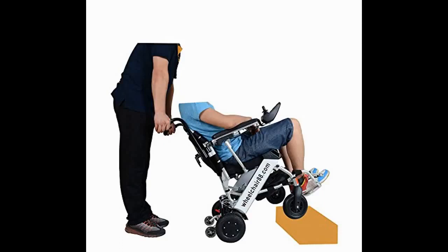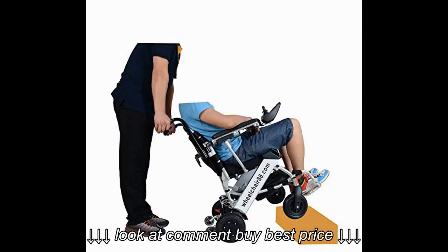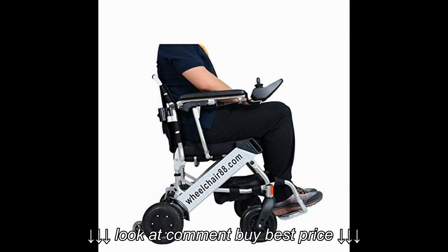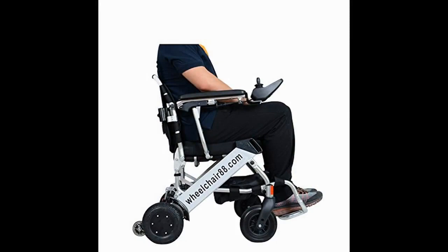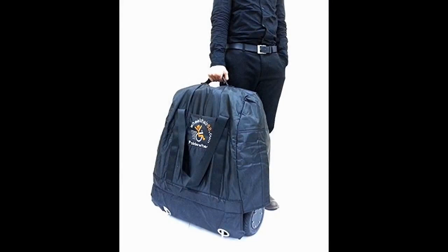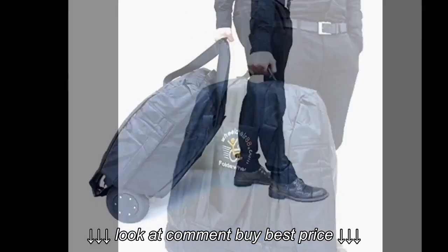Hi. I bought this chair for my wife. Most electric wheelchairs are big, bulky and heavy, and unless you have a vehicle large enough for one, or a trailer hitch and platform designed to carry one, traveling with one of those other chairs is a big hassle. So much so that my wife was resigned to being pushed in her regular chair whenever we went out.